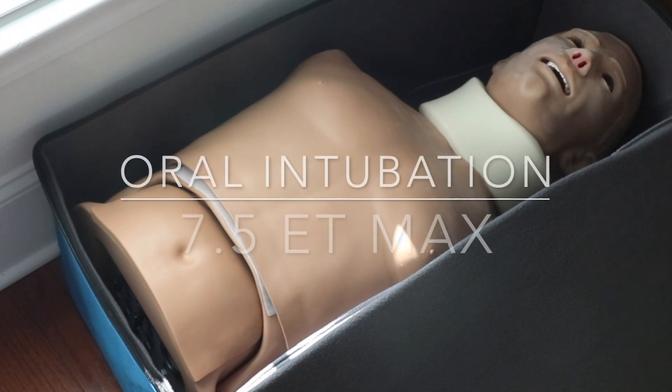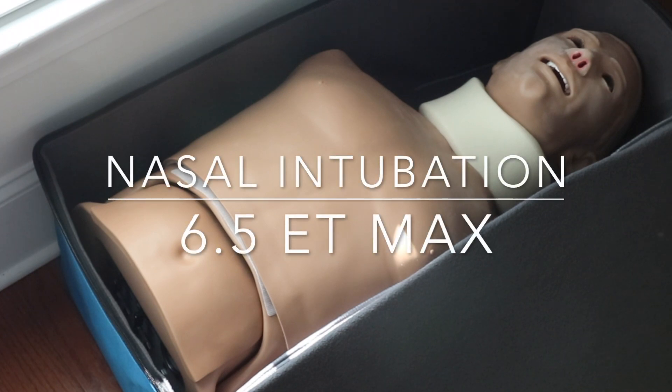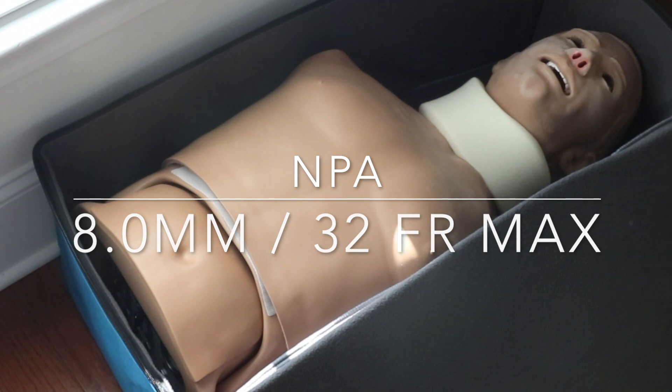As far as oral intubation, the maximum ET tube size needs to be no bigger than a 7.5 — everything I read encourages around a 7.0 ET tube. If you do nasal intubation, which not a lot of people practice anymore, it's a 6.5. For NPA, we're going to be using NPA — either an 8 millimeter slash 32 French is going to be the max.